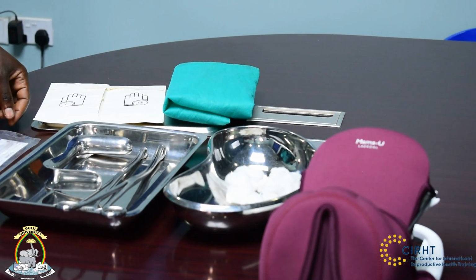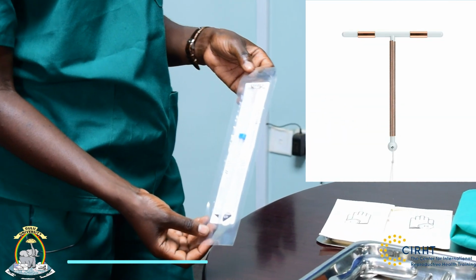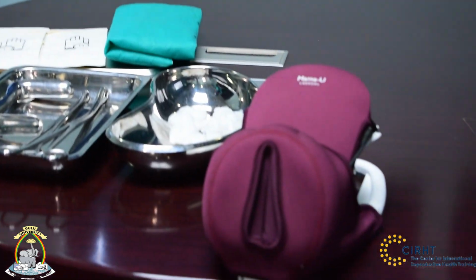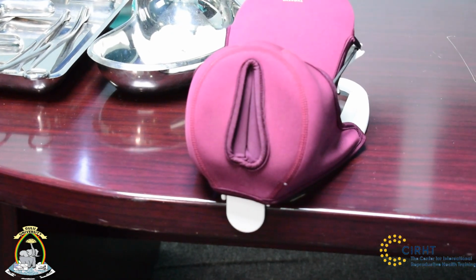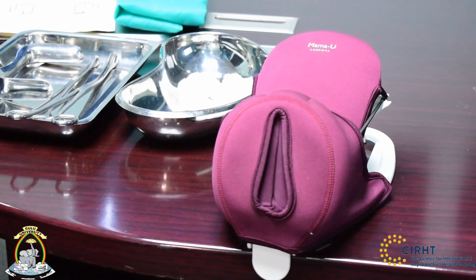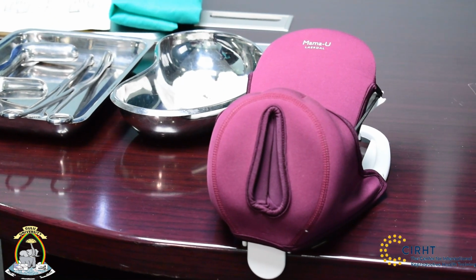And then finally, we have our PPIUD. So this is our IUD that we shall be using for this procedure. And then also finally, we need to have the mother. We need to have the mother positioned in a lithotomy position, and we need to have her positioned well, and of course we should have some drapes underneath her buttocks. So that is all we need for the procedure. So let's dive in to the procedure.